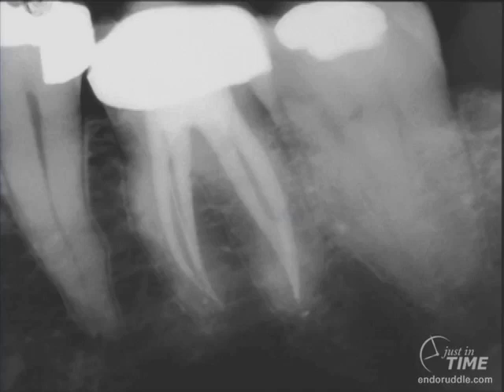Notice the crown has been replaced provisionally, and I'll let the general dentist decide if they want to utilize this crown in the future or if a new crown in fact should be made.